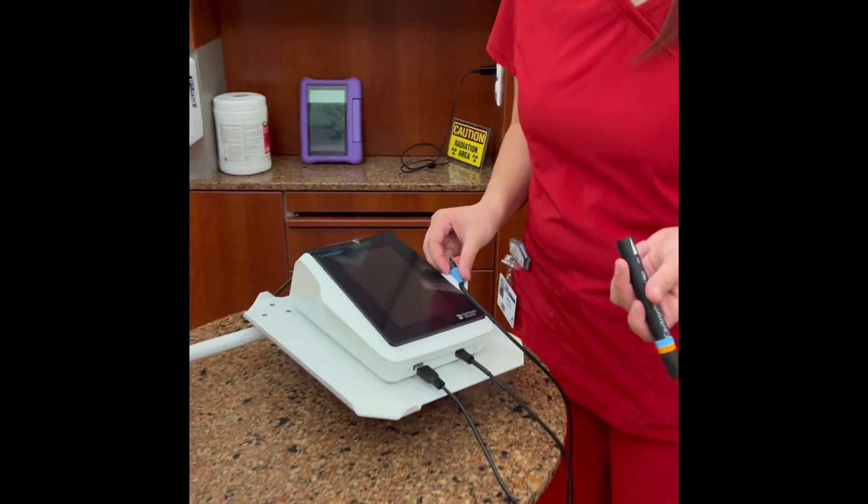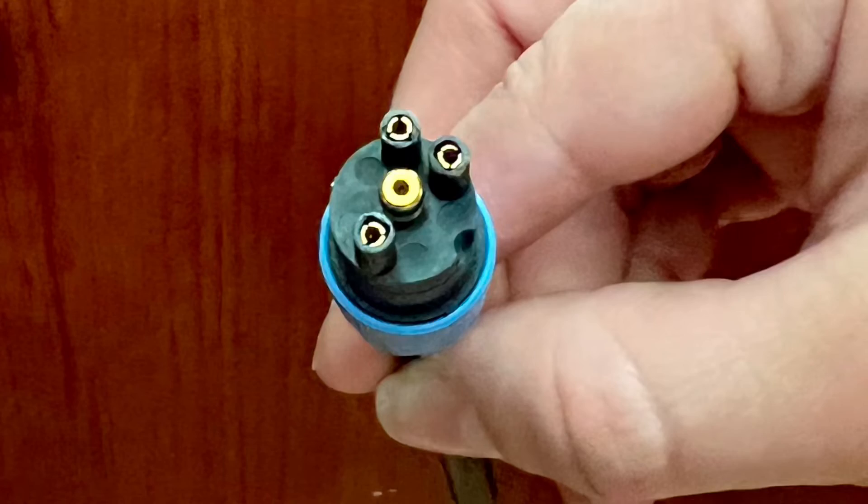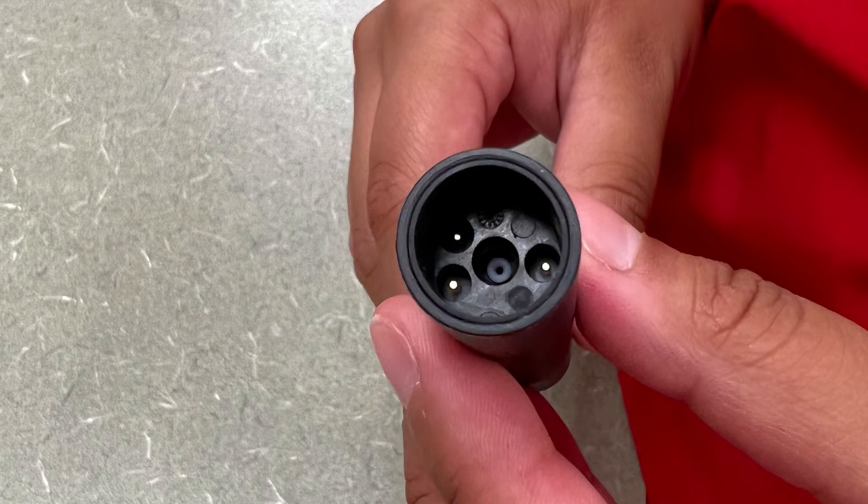Next, connect the SteriMate. Line up the three prongs on the cord to the three connections inside the SteriMate.